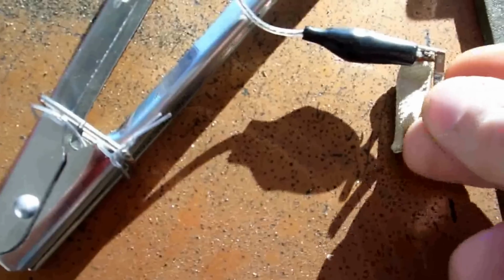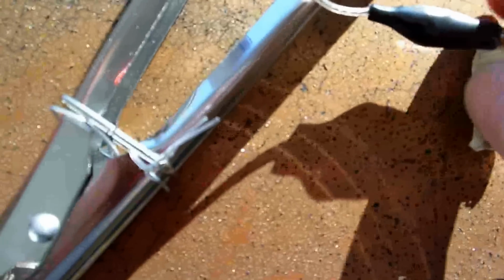So basically, this thing just clips on here like that, and this will sit right underneath that band with some water on it. The water will conduct electricity, and this will sit right underneath the band with the metal inside of it and pulse into the blood below it, and that's all there is to it.